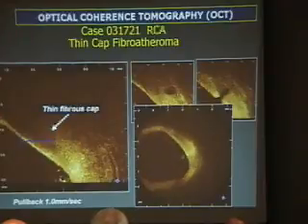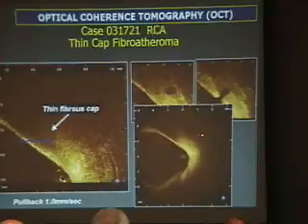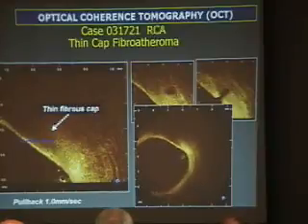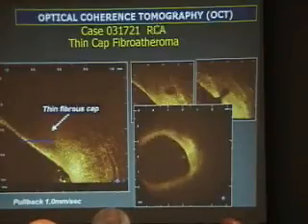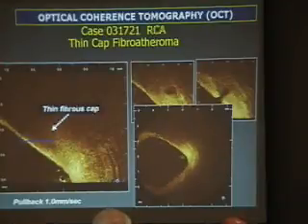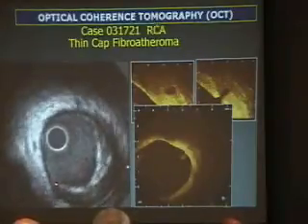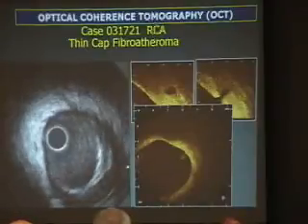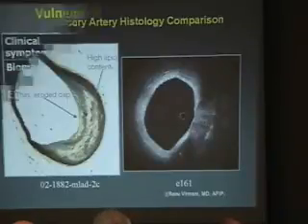The second thing which is amazing is there is a small vessel of less than 50 micron joining the lumen just at the edge of these crescents. We don't know the interpretation of that, but I would not be surprised if echo contrast would penetrate the vessel wall at that site and illuminate the vessel wall. We have interpreted it as potentially a fibrous cap, and we can try to correlate that with the IVUS, and you see clearly here the wobbling motion at the edge of this cap. And that reminds me very much of the histology of Renu Virmani.